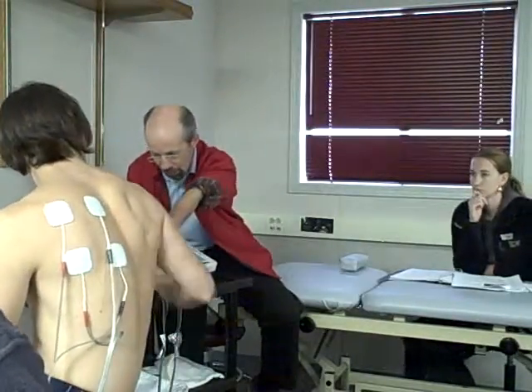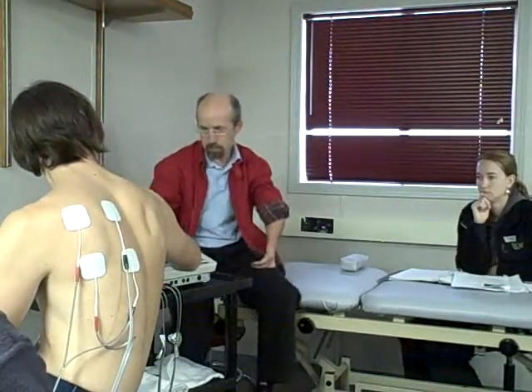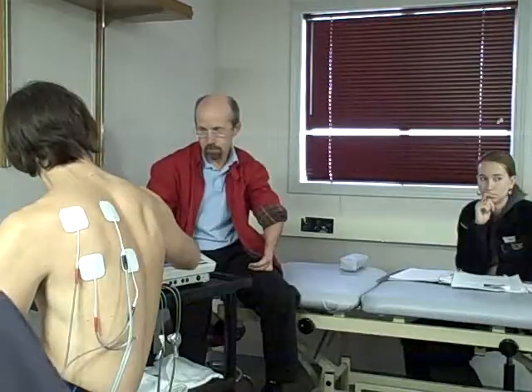Press the channel and adjust it here, press channel 2 and adjust it. Can you do different channels, so if you're in IFC you can automatically adjust both of them? Not when you're in the middle of the program. So you can actually separately adjust it, even in quad? Correct. Yeah, that's what we're doing right now. You just press channel 1, change it, press channel 2, change it.